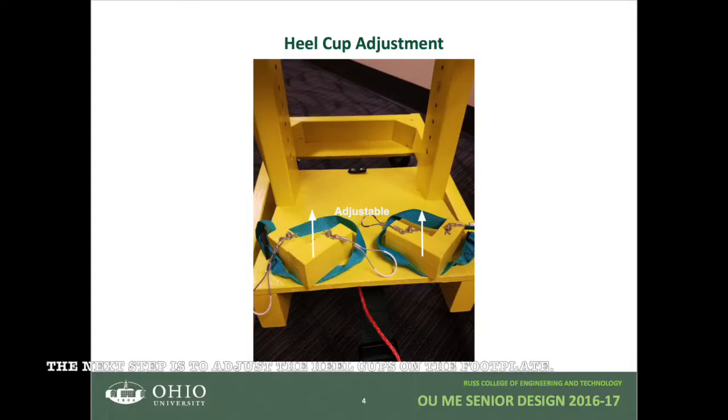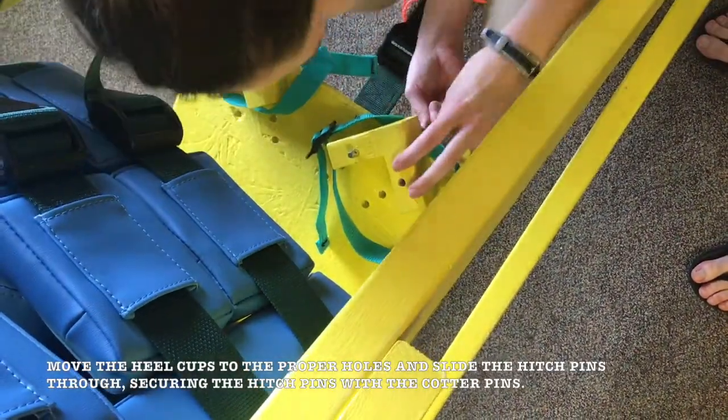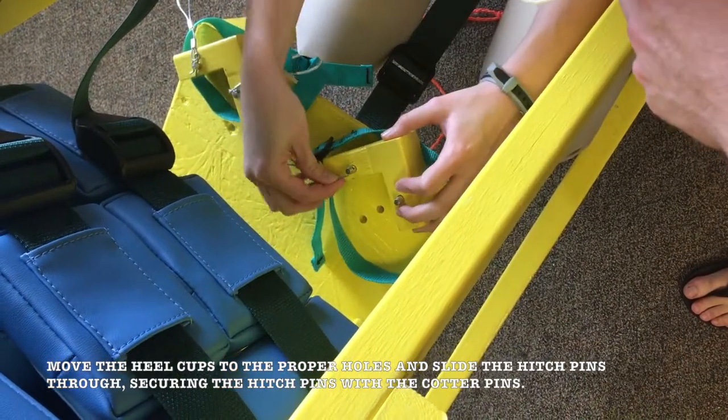The next step is to adjust the heel cups on the footplate. Move the heel cups to the proper holes and slide the hitch pins through, securing the hitch pins with the cotter pins.